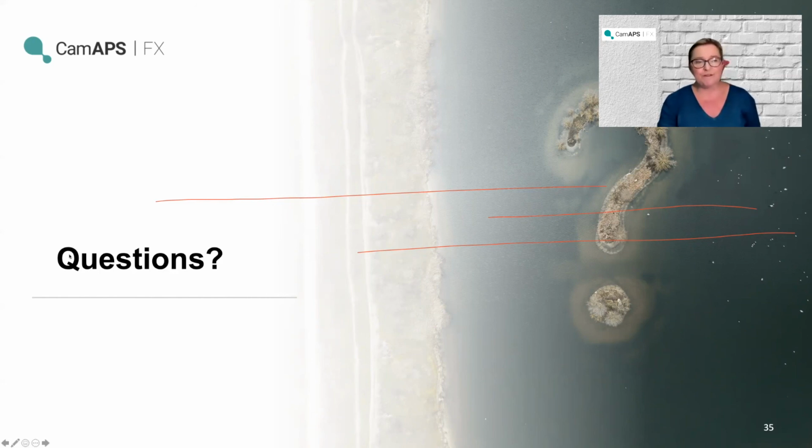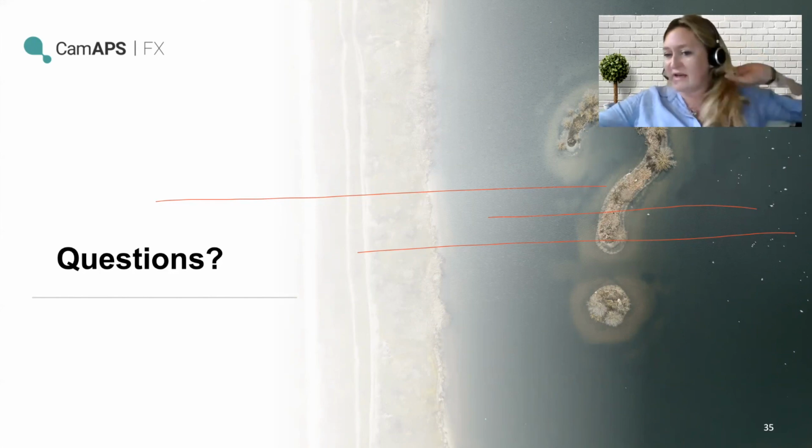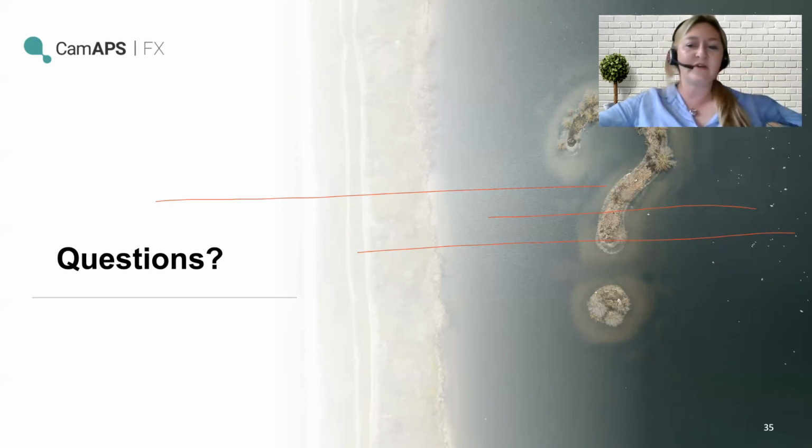Any last questions before we bring this very interesting webinar to a close? Go has just asked about the trial sites for the pilot. People have been asked to put in, so they've gone to all the biggest pump centres and asked to provide data, because they're looking particularly for people who are on pumps and Libre, because that's how the funding will work. They only really want to fund the difference between Libre and pumps, and you could potentially argue that if someone's on a pump but not getting the optimal control we'd like to see, the first step would be to put them on Libre with their pump, and then closed loop or CGM with closed loop would be the next step in the pathway potentially.